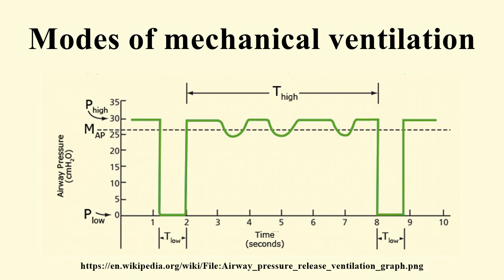APRV is currently the most efficient conventional mode for lung protective ventilation. Different perceptions of this mode may exist around the globe. While APRV is common to users in North America, a very similar mode, biphasic positive airway pressure, was introduced in Europe. The term APRV has also been used in American journals where, from the ventilation characteristics, BiPAP would have been perfectly good terminology. But BiPAP is a trademark for a non-invasive ventilation mode in a specific ventilator. Other manufacturers have followed with their own brand names.